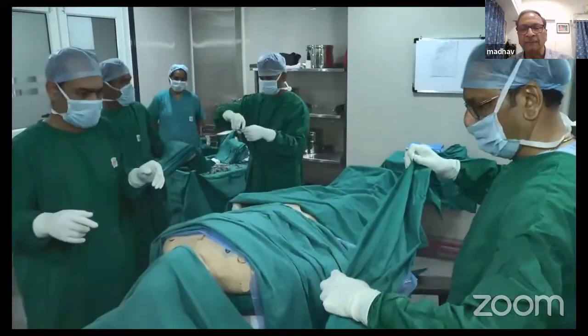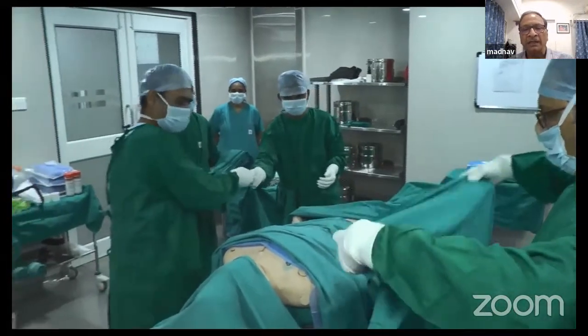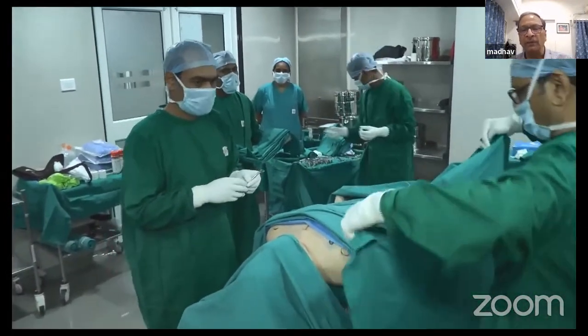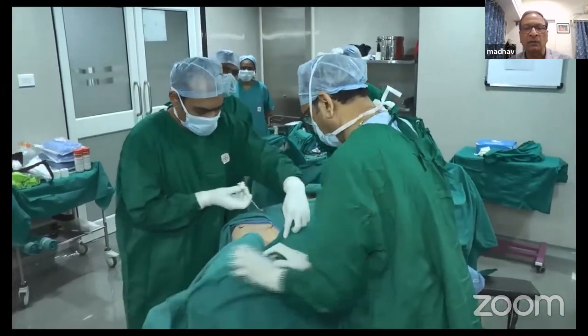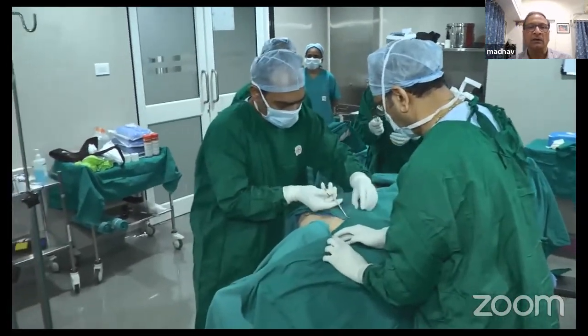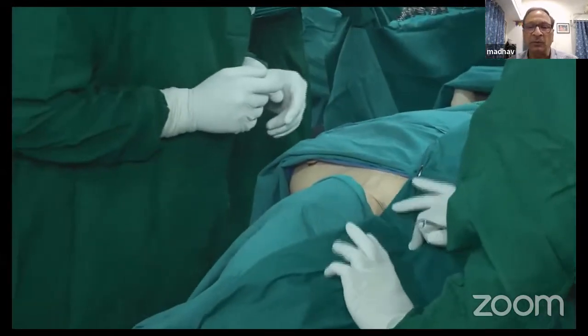So as you can see, part of the iliac crest is being left open in between. So probably that is also taken care of for the graft that you may need for the cervical procedure.